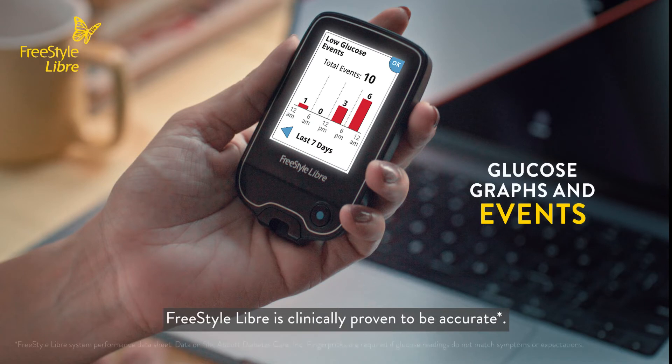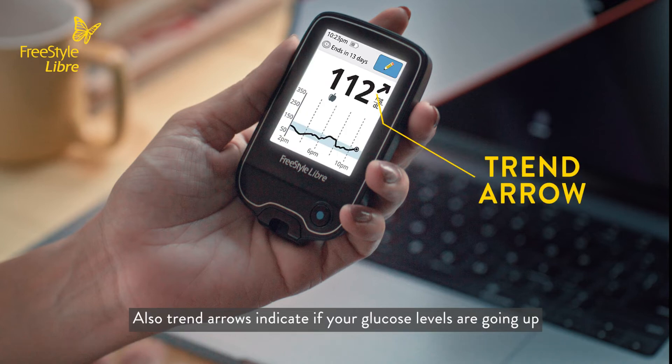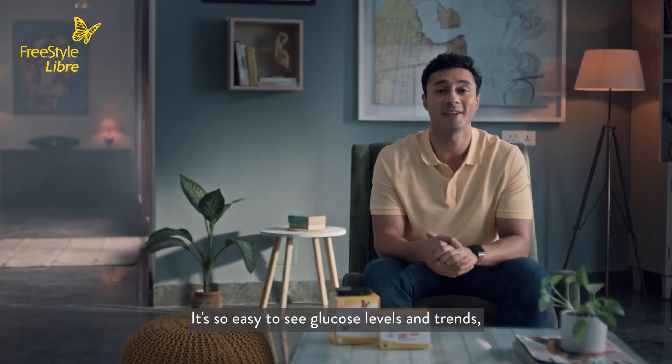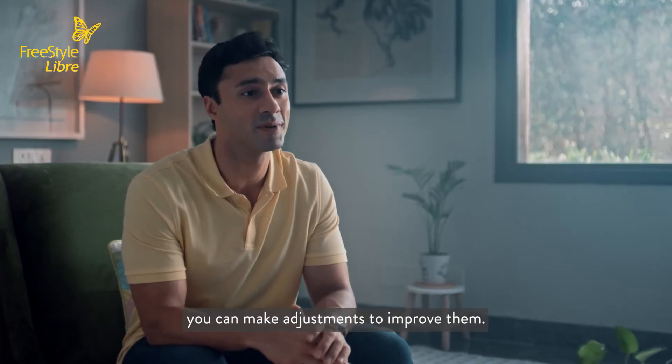Freestyle Libre is clinically proven to be accurate. Trend arrows indicate if your glucose levels are going up or down or are steady. It's so easy to see glucose levels and trends, and you can make adjustments to improve them.